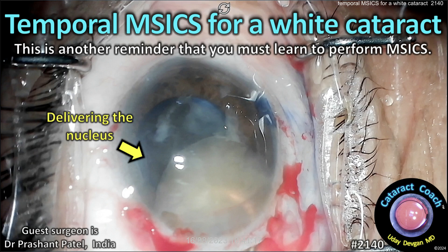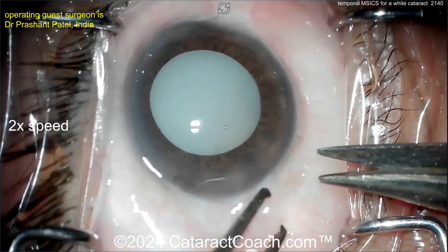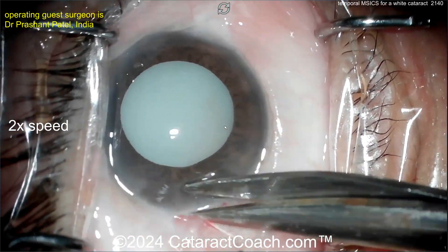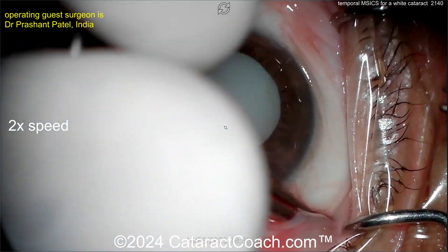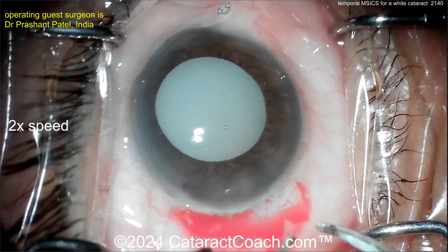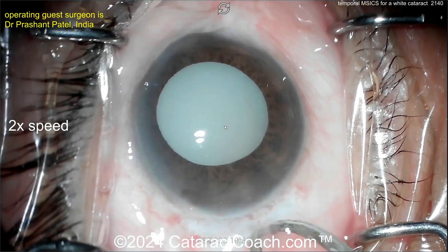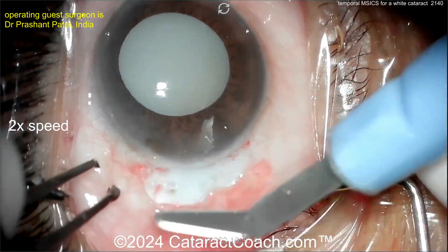cataractcoach.com — temporal MSICS for a white cataract. This is another reminder that you must learn to perform MSICS. You can sit temporally and do a peritomy. Why would you sit temporal versus superior? It depends on surgeon preference or patient anatomy — a very deep-set eye, overarching brow, or tight palpebral fissures. Now doing a little bit of cautery here, and that looks pretty good.